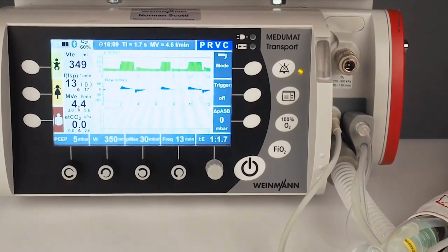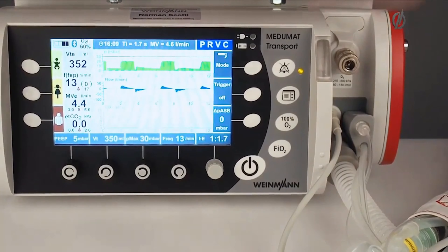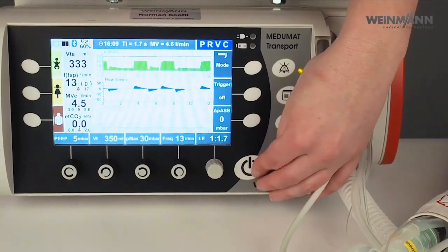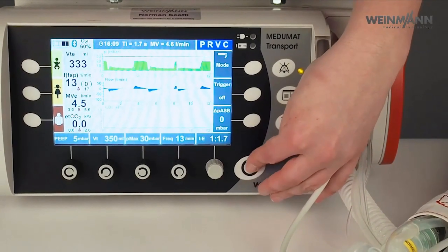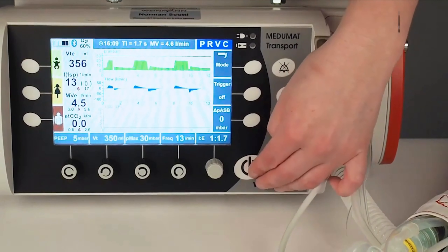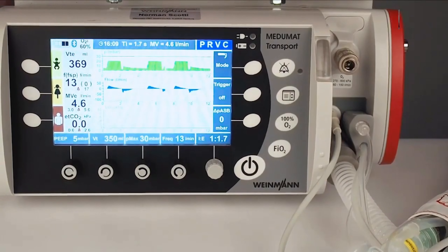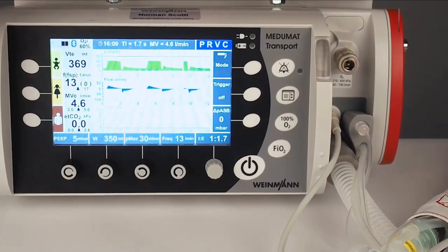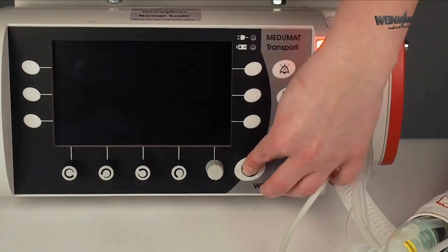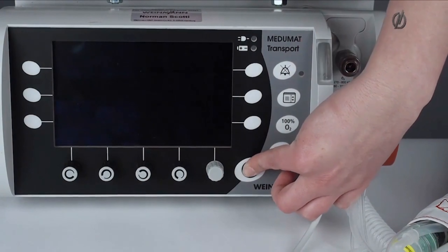This is basically the minimum transport ventilator — very quick and very easy. When finished with ventilation, I turn off the device. There is a special thing: by pressing the on/off button very briefly, the device goes into standby mode. In standby mode the device draws power from the battery but starts up really quickly. If you want to really turn off the device, make sure to press the on/off button for more than three seconds until the alarm light turns off.